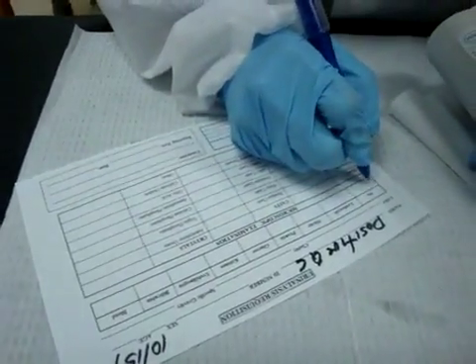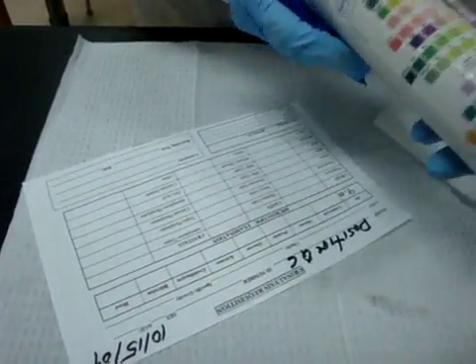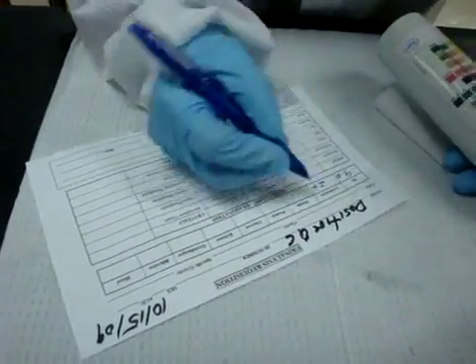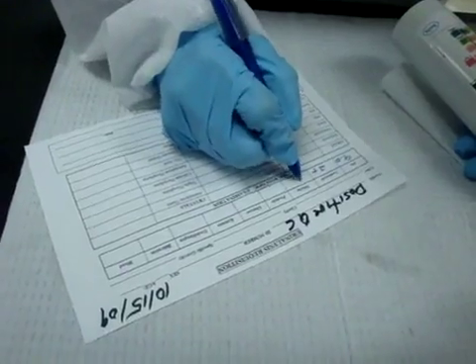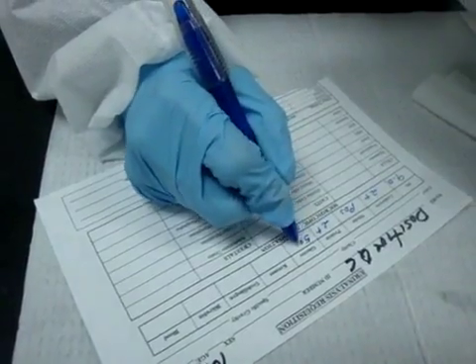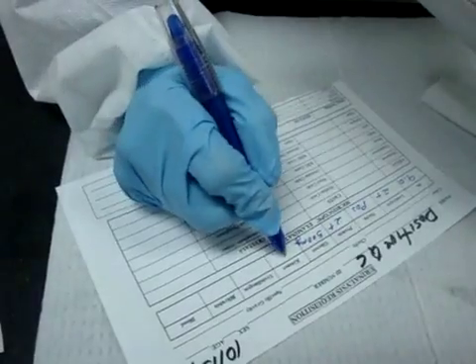The pH was 9. The leukocytes we can see now are positive. It's a 2 plus leukocytes. Nitrites are only reported positive or negative, so they are positive. The protein is 2 plus. The glucose was 500 milligrams, not milliliters. Ketones were 2 plus. Urobilinogen was 4 EU.